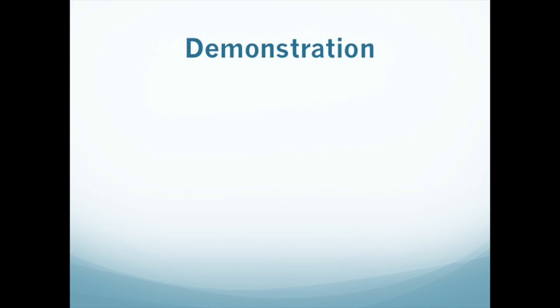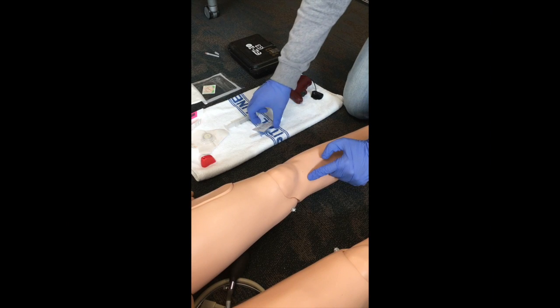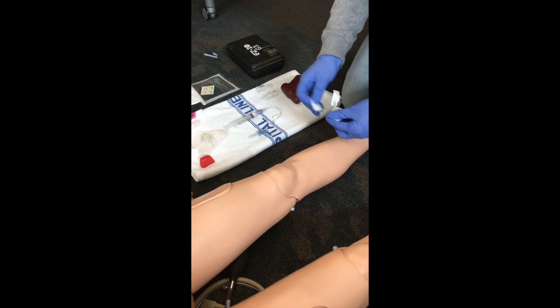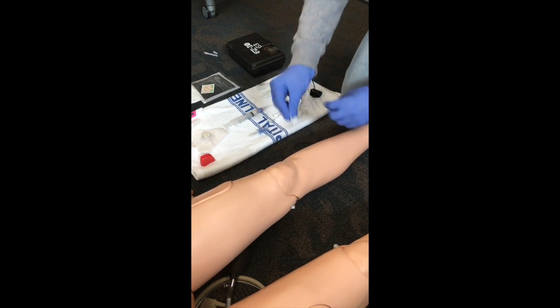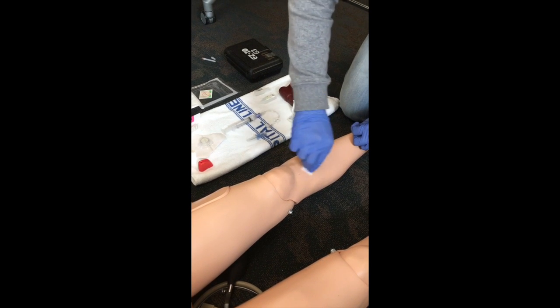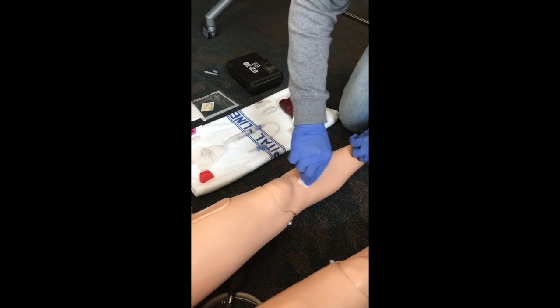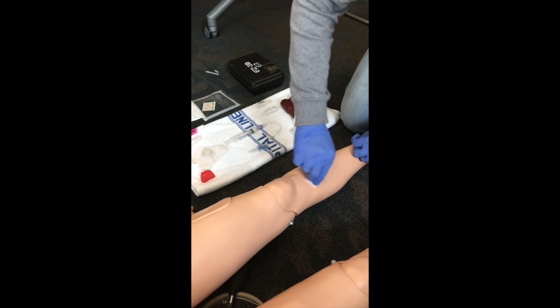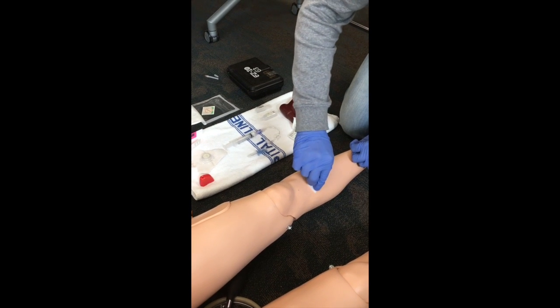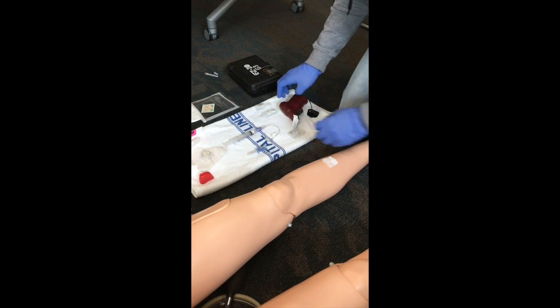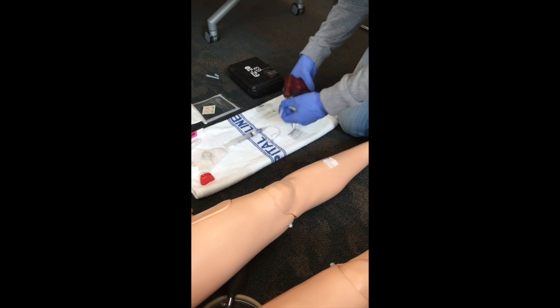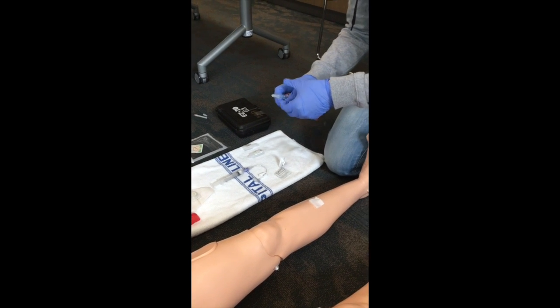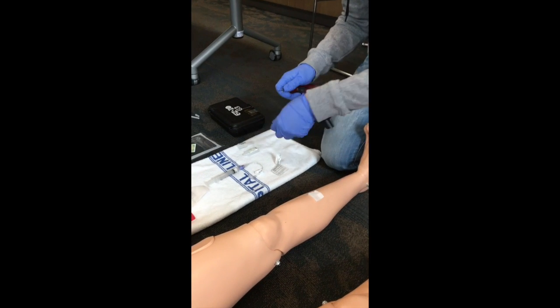Now begin by thoroughly cleaning the site with alcohol or chlorhexidine. Aseptic technique is very important as this can mitigate the risk of infection. Firmly attach the appropriate size needle to the needle driver and remove the cap.